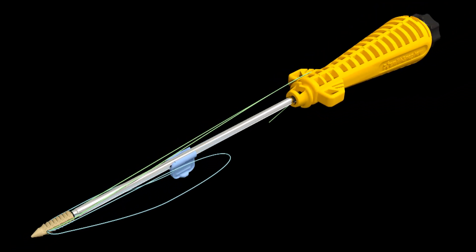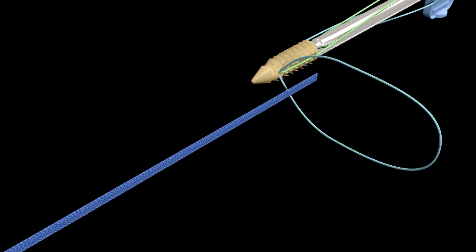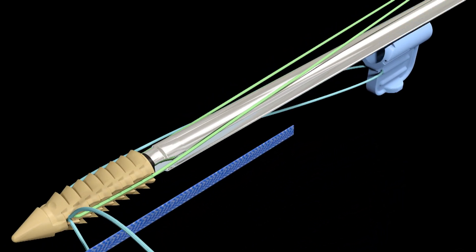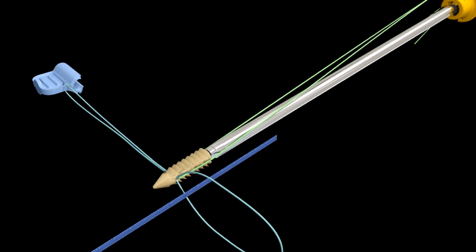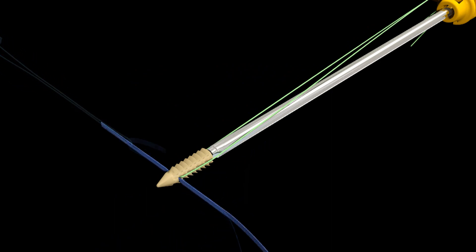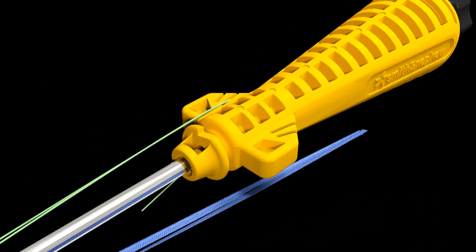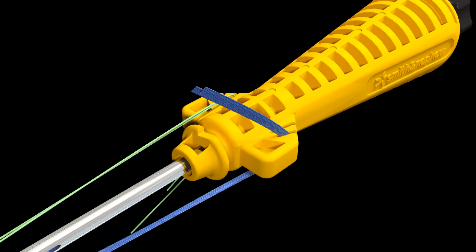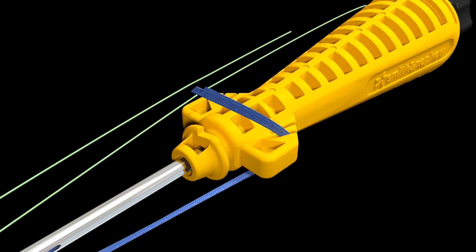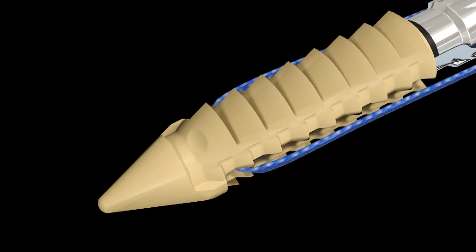Prior to starting the repair, the two Footprint Ultra PK suture anchors to be used in the medial location of the greater tuberosity are pre-loaded with Ultra Tape. Releasing the looped suture from the threader tab, thread one limb of Ultra Tape through the loop and pull through the anchor eyelet, ensuring both limbs of Ultra Tape are of equal length. Fix them over the cleats on the inserter handle.